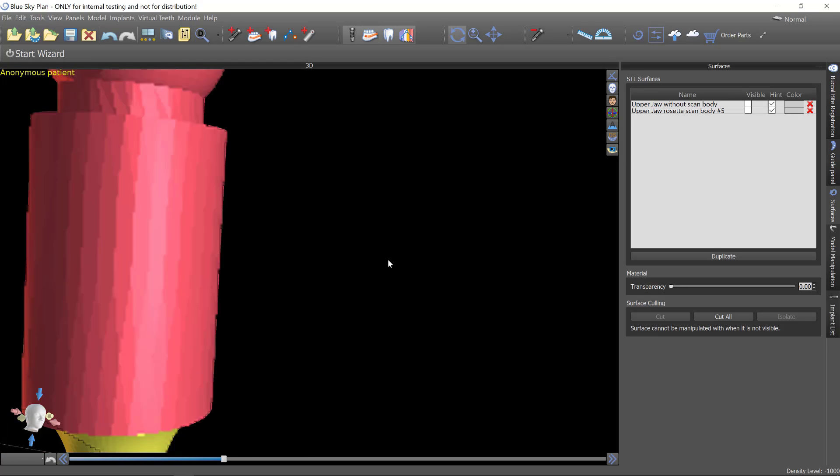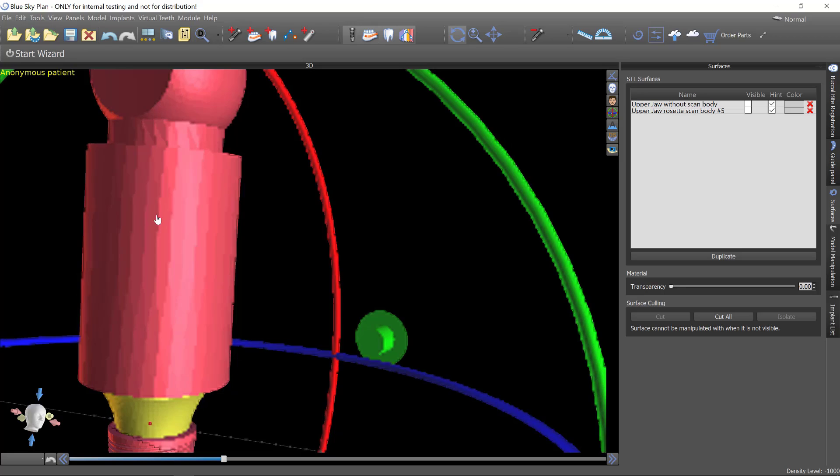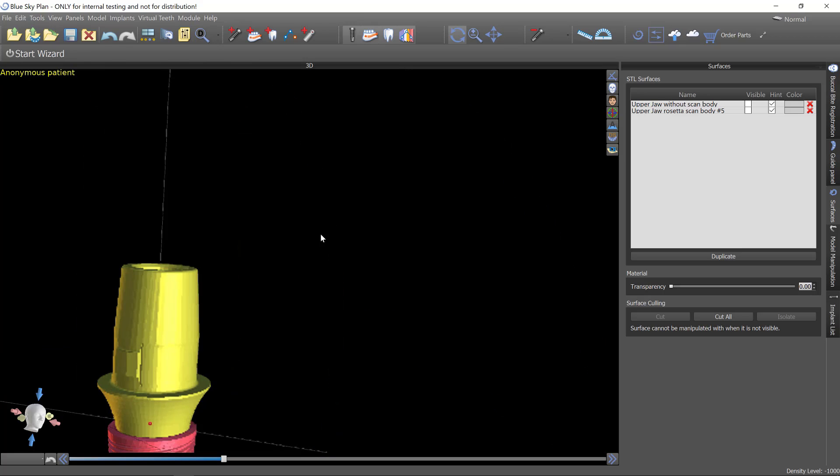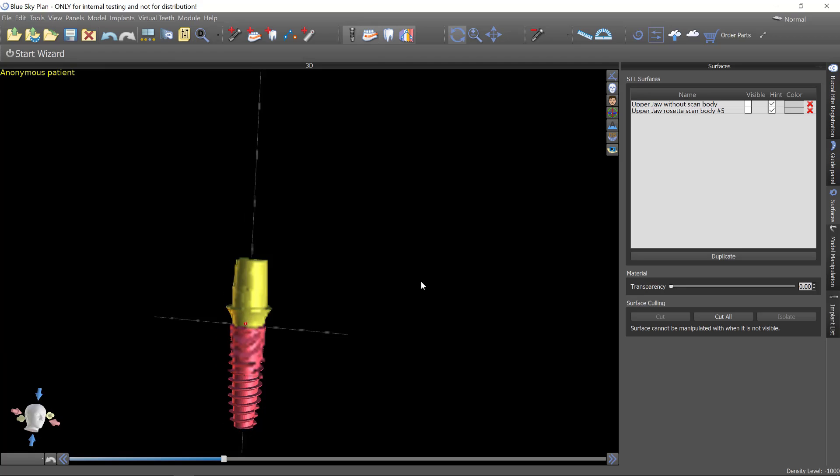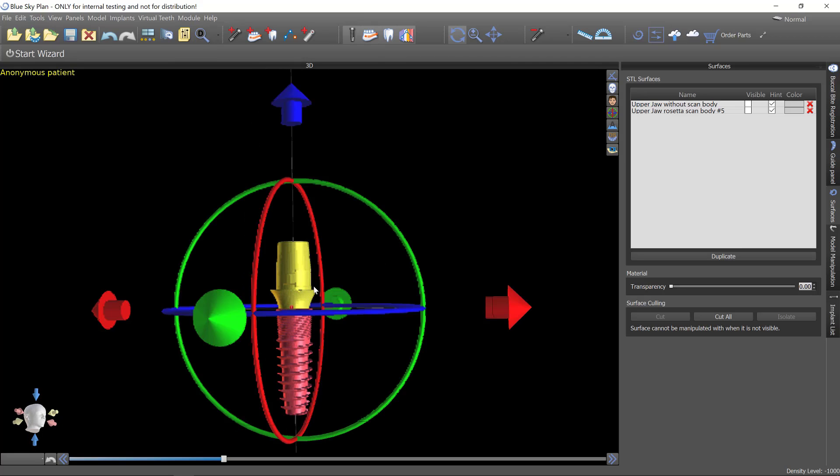So now that everything is registered I can right click the scan body and delete it. Because I no longer need that now that everything is registered. Everything from here forward is going to work directly on this tie base.